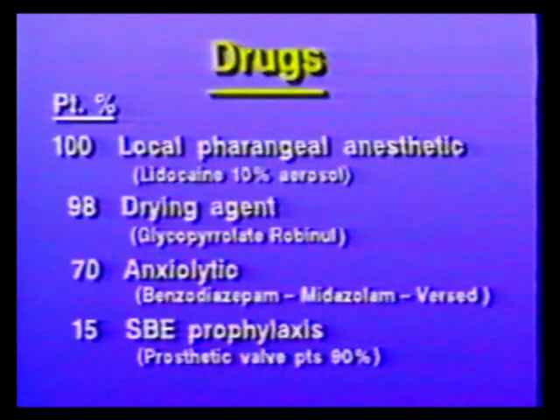Drugs are variably used during the transesophageal examination. In our own experience, 100% received local pharyngeal anesthetic, 98% received an anticholinergic drying agent, 70% received mild general sedation, and 15% received subacute bacterial endocarditis prophylaxis.